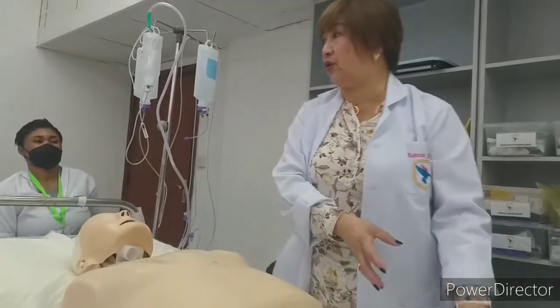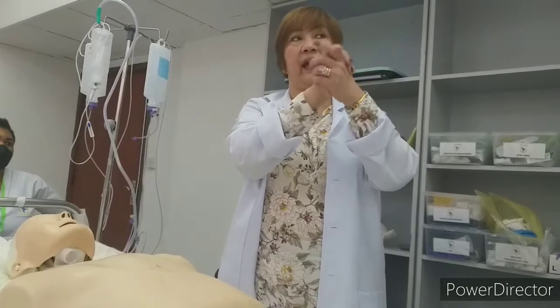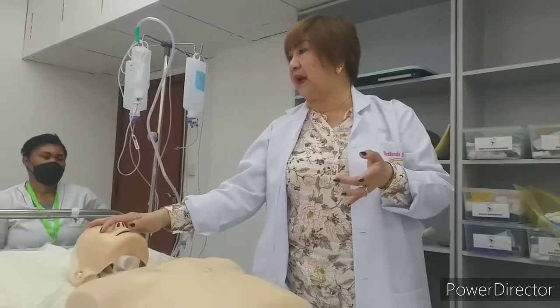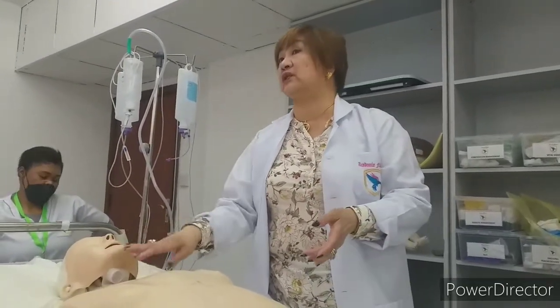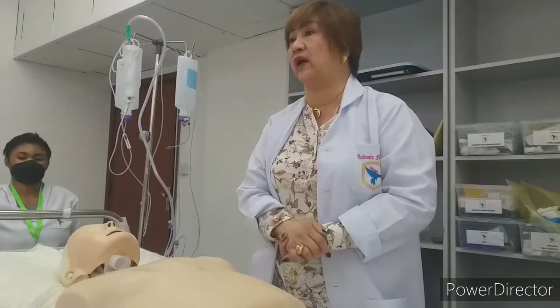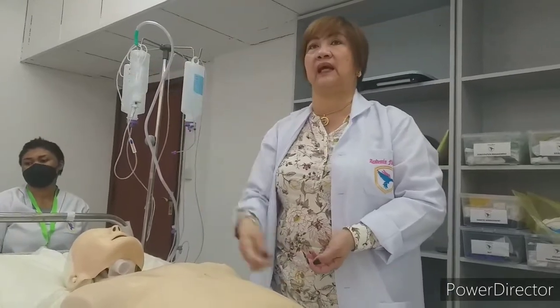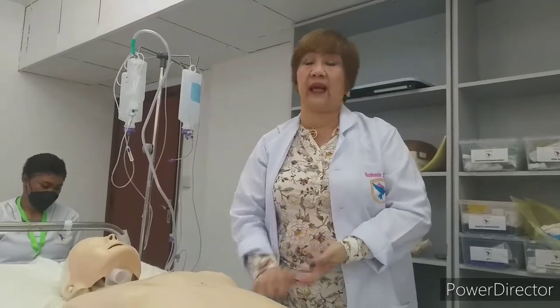Okay, same way, whatever you used, throw it to the medical waste, come back with hand hygiene, and come to the patient and document what you have done. Okay, document everything. How did you observe the patient? Patient is very dyspneic, so requires oxygen administered 1 liter per minute, and patient was relieved. Okay, so this is all our suctioning and oxygen administration.